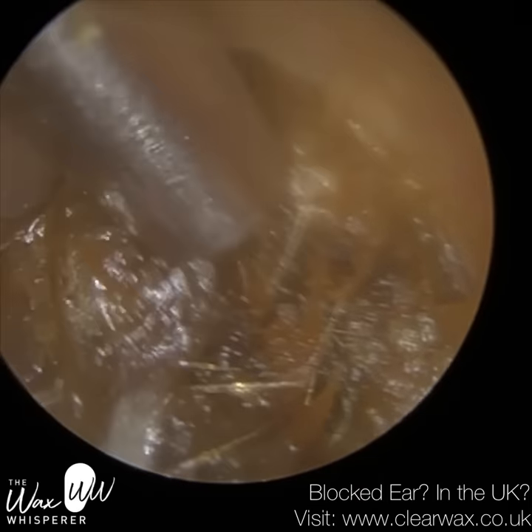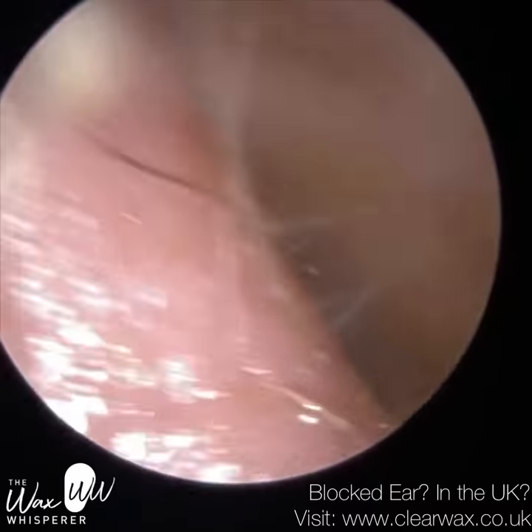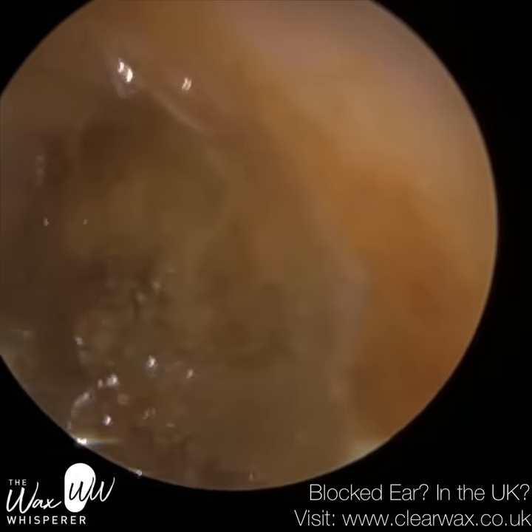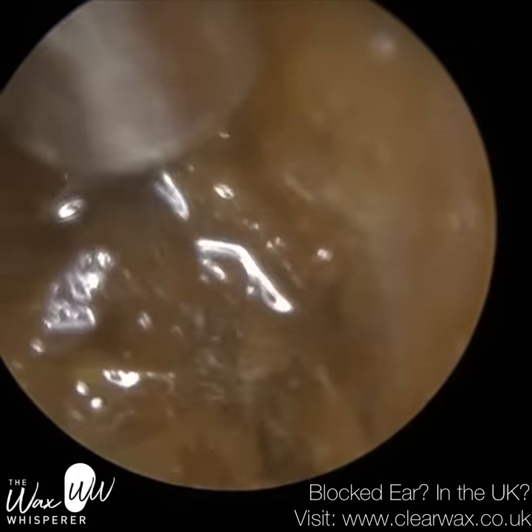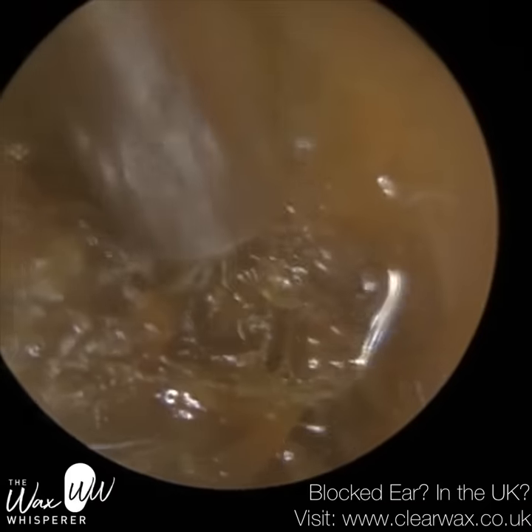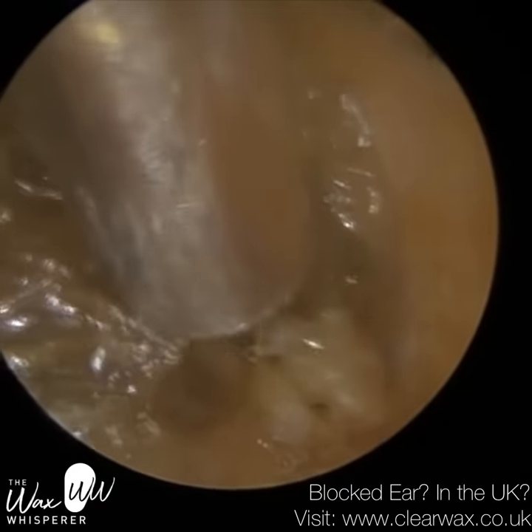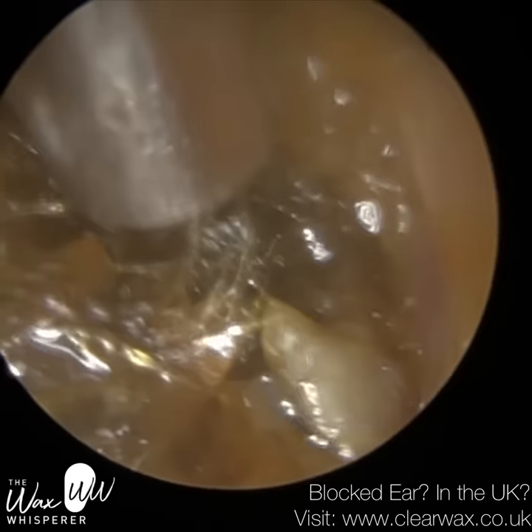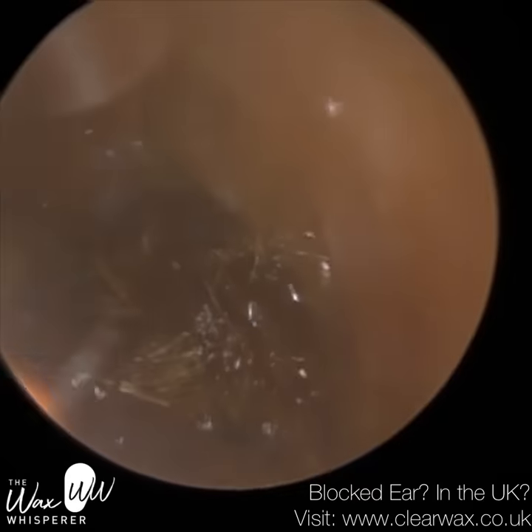And you can always tell when someone's used hydrogen peroxide drops, it turns the wax very mushy and glutinous, almost like a mashed potato consistency. Sorry to anyone who's having mashed potato for dinner this evening. And it can make it a bit more difficult to remove. So I've just put some olive oil spray in here just to help bind the wax together, change the consistency.